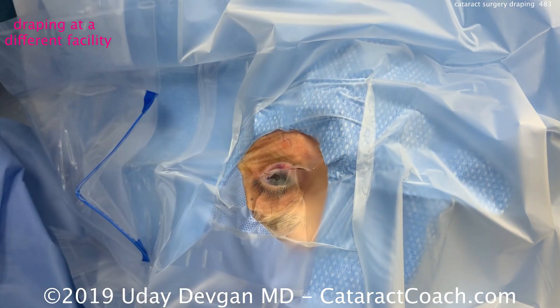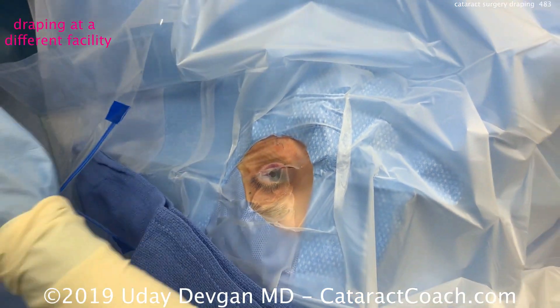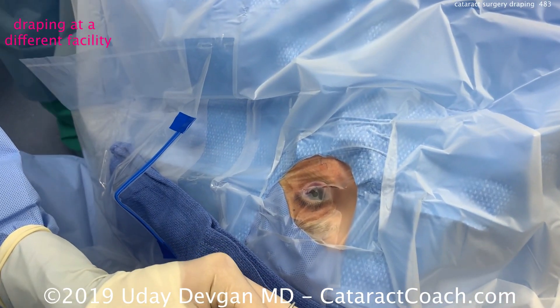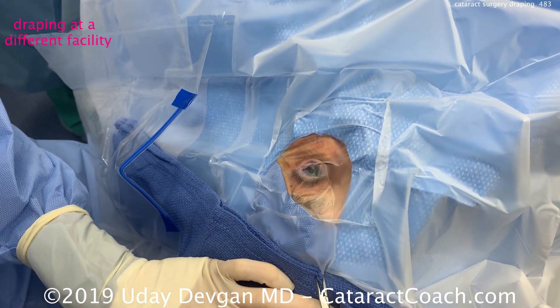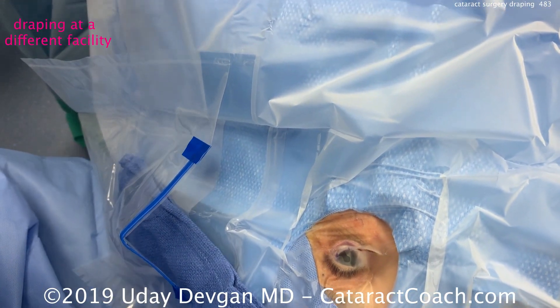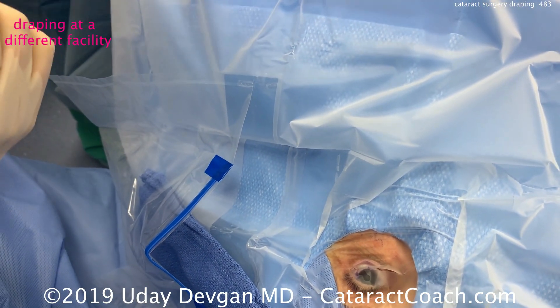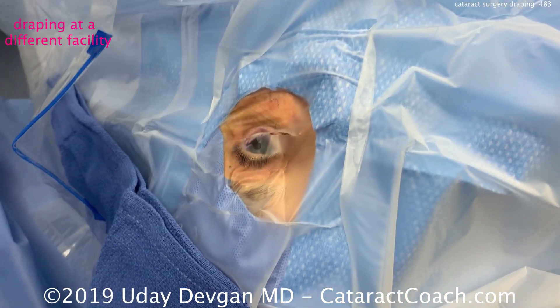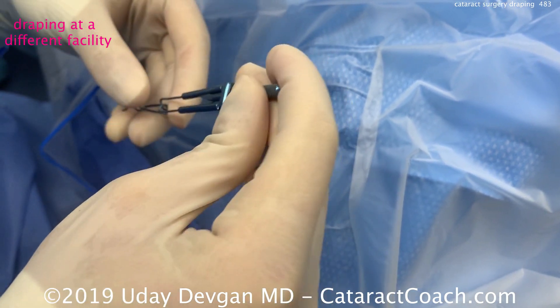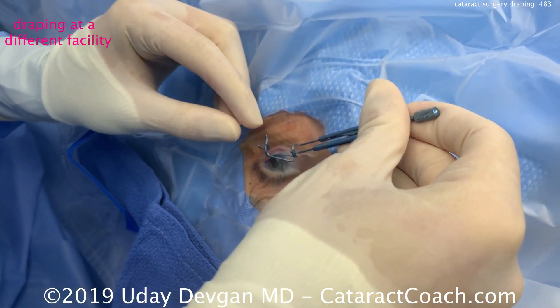Now he's incising the drape right down the middle, putting a little extra towel here to absorb any fluids during the procedure. Then a speculum is going to go inside the eye, and the goal of the speculum is to make sure those plastic drapes encompass and go around the lid margin. You can see that's very good — every eyelash is out of the way and underneath the drape. Here comes the speculum being placed.